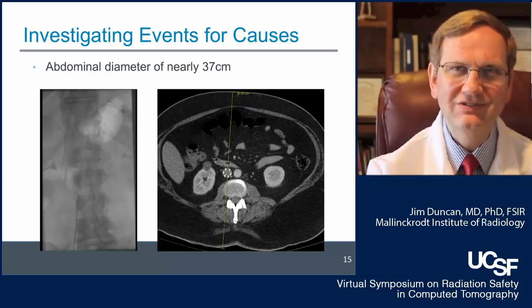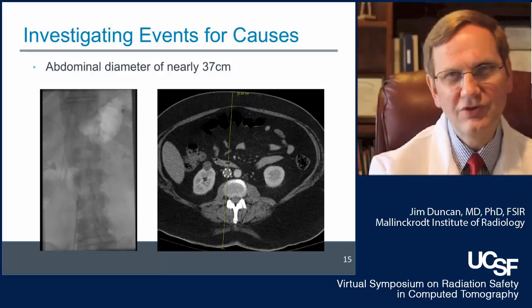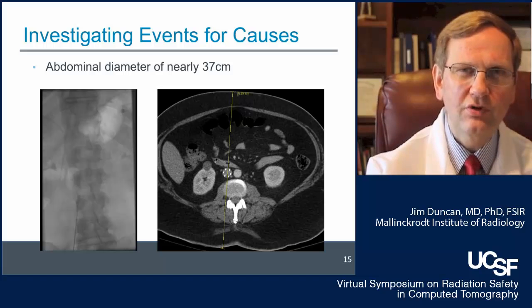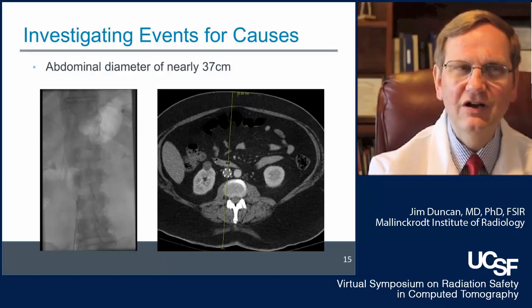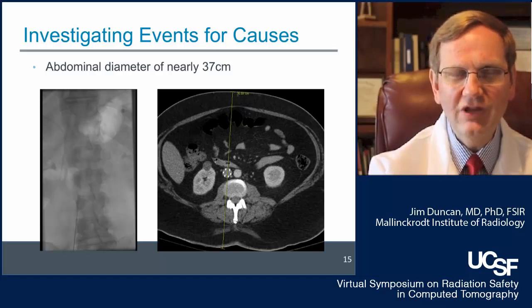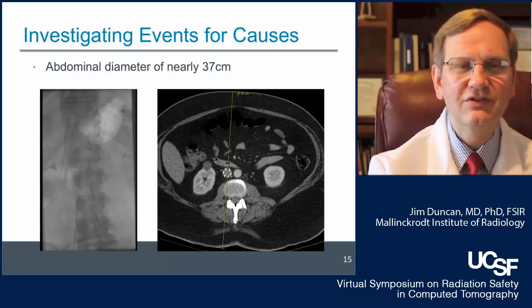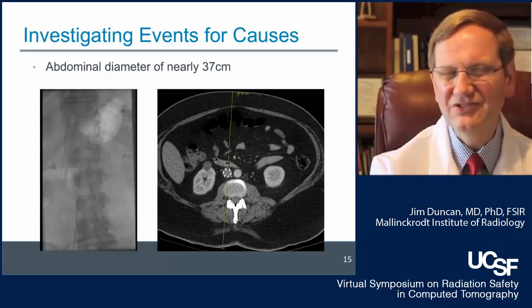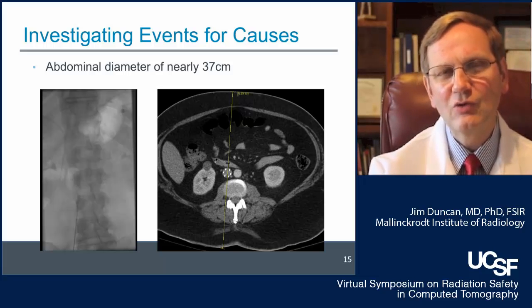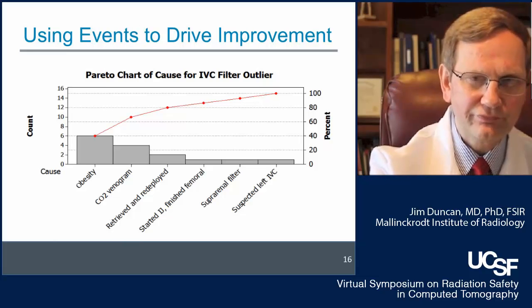There's nothing on the image saying that we're sending in many photons and only a few get through to the detector. It would be much more useful if the tone for fluoroscopy were actually to reflect the intensity of the beam. A low-level tone, sort of a rumble, for someone who's thin and there's little attenuation of the beam, whereas a high-pitched and relatively irritating scream for when we're sending in many photons and only a few make it to the detector would be useful.